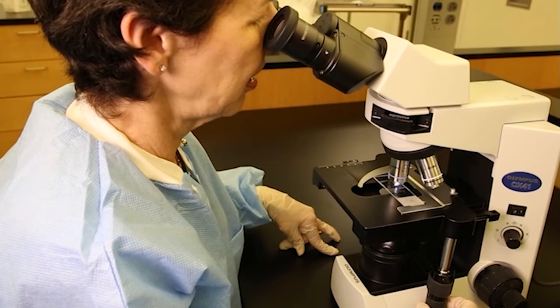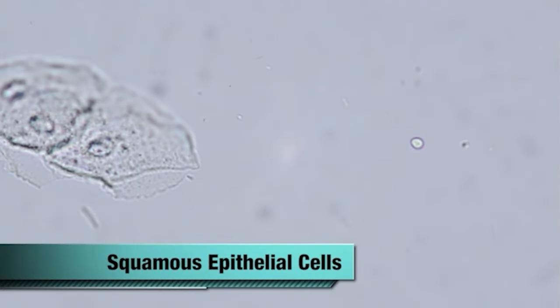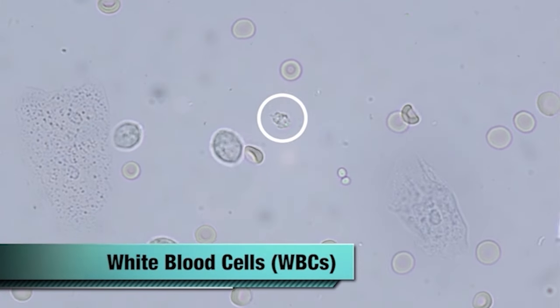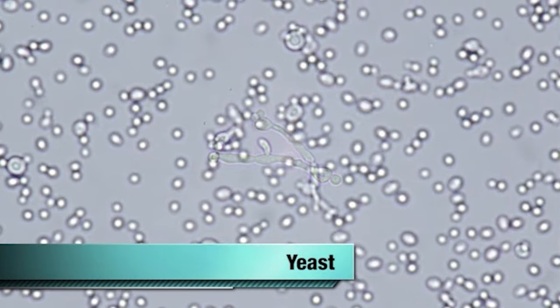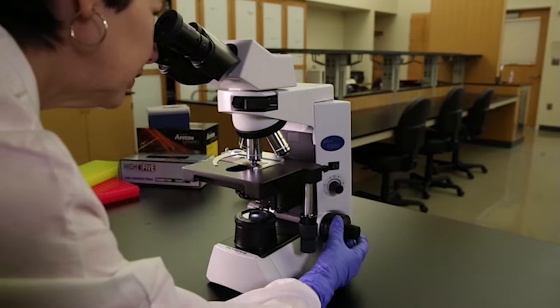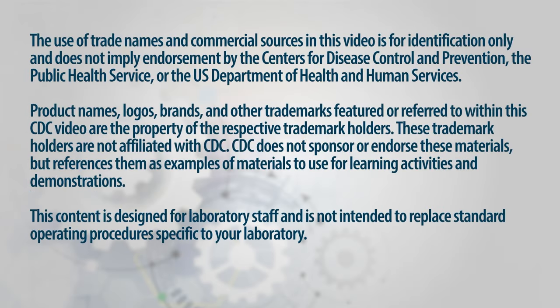It's important to also report other objects seen in a wet mount such as squamous epithelial cells, clue cells, white blood cells, red blood cells, and yeast. These findings are important to the physician to rule out infection.